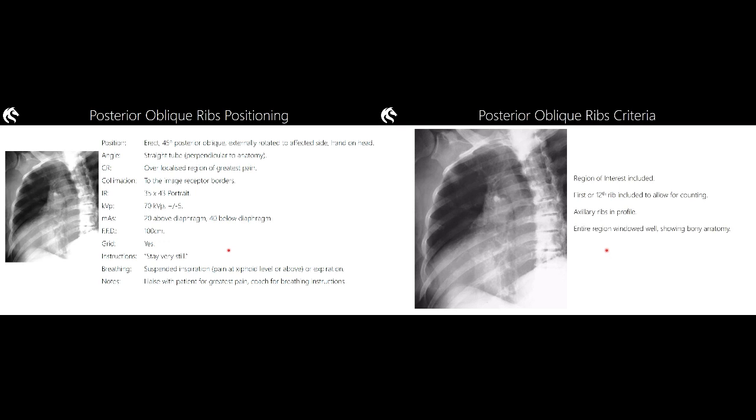In a right posterior oblique, you're looking almost down the barrel of the heart, from the apex to the body of it. For that reason, when you have a patient who has a right posterior oblique, you're going to have the heart over part of the ribs and lung over part of the ribs. So when it's right-sided ribs, you may need to do an additional projection on a different exposure depending upon where the heart sits relative to those ribs. Does that make sense? All right.